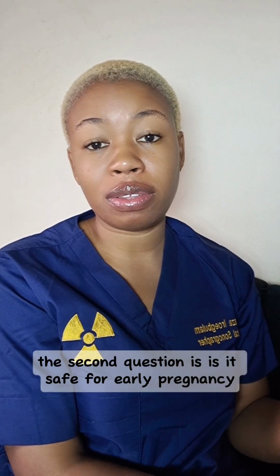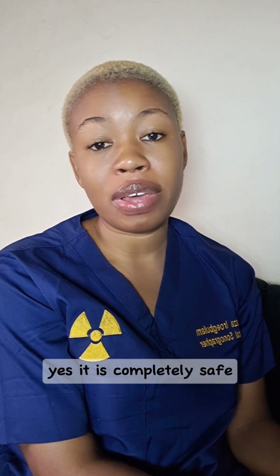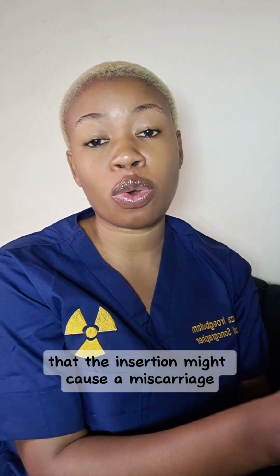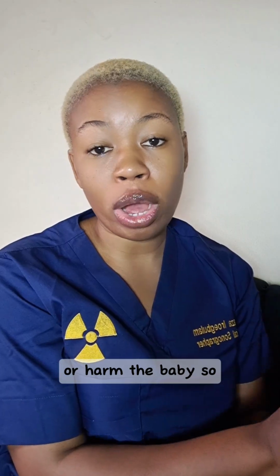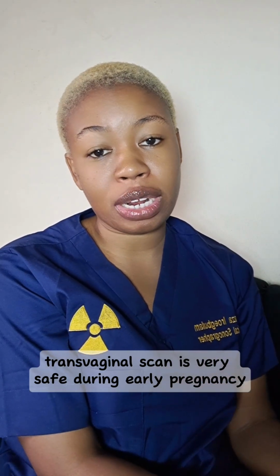The second question is, is it safe for early pregnancy? Yes, it is completely safe and it does not have the ability to cause miscarriage, because most patients are scared that the insertion might cause a miscarriage. The insertion of the probe into the vagina does not have the ability to cause miscarriage or harm the baby. So a transvaginal scan is very safe during early pregnancy.